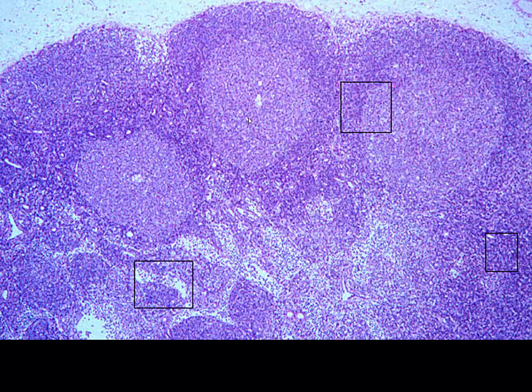So again, looking at higher magnification, we can see the cortex, the outer capsule of our lymph node. We've got some trabeculae diving down. It's kind of hard to see those in this particular image, but very easy to pick up our secondary lymph nodules with a lighter germinal center. And here we have our medullary sinuses and medullary cords of cells between.